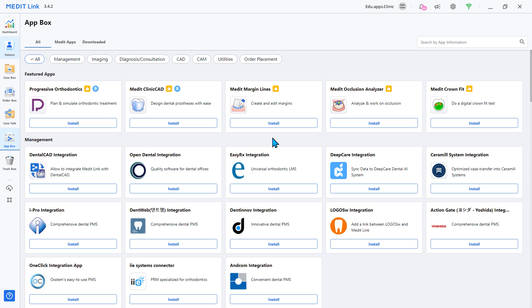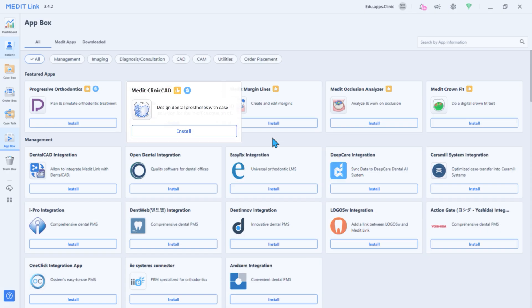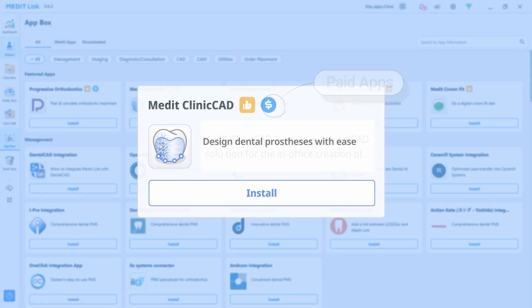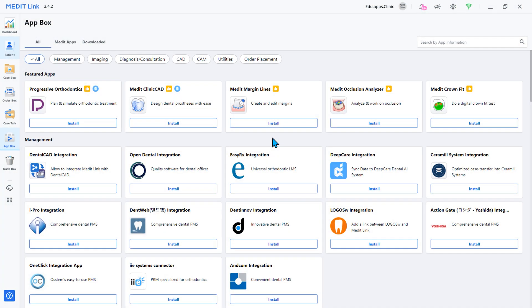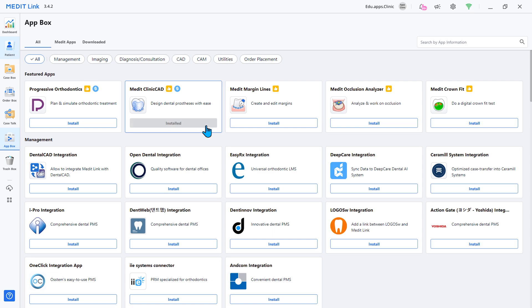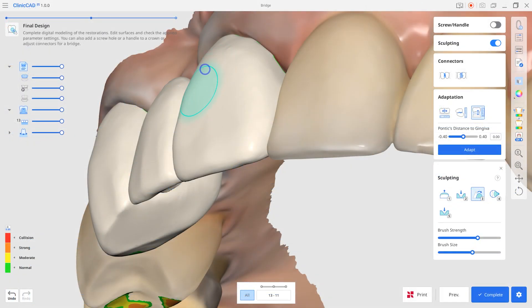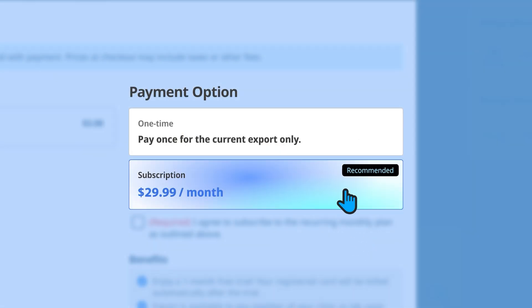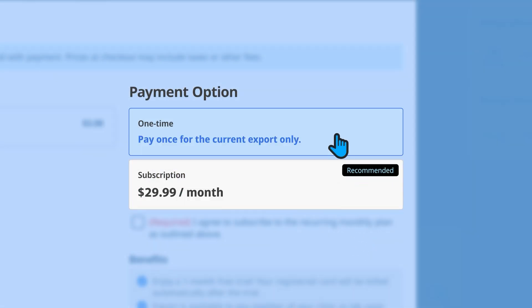Welcome. In this video we explore the paid plans and Medit apps. Some apps and Medit apps require payment. In the app box, paid apps are marked with a dollar icon. The app may be paid, but installation and design trials are free, so anyone can freely use the app up until extracting a design file. To extract a design file in paid apps, choose one of two payment options.